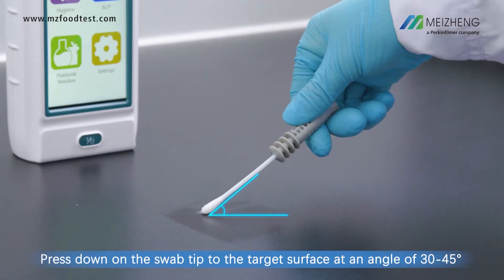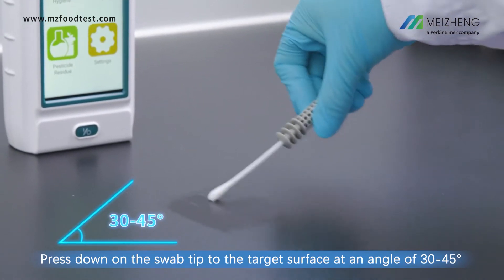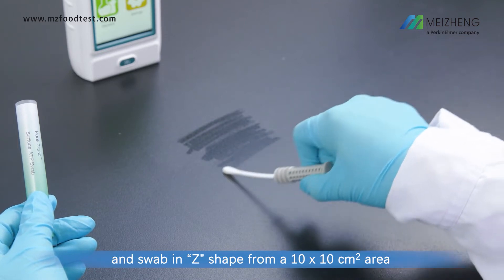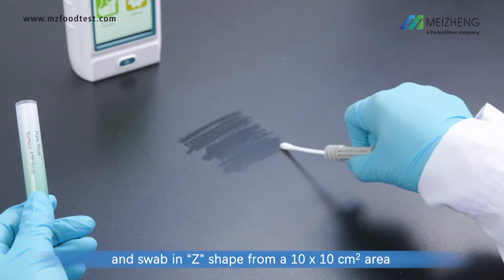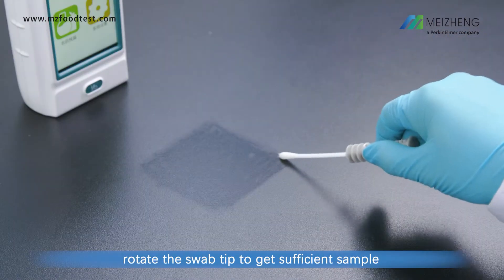Press down on the swab tip to the target surface at an angle of 30 to 45 degrees, and swab in a Z-shape from a 10x10 square centimeters area. While swabbing, rotate the swab tip to get sufficient sample.